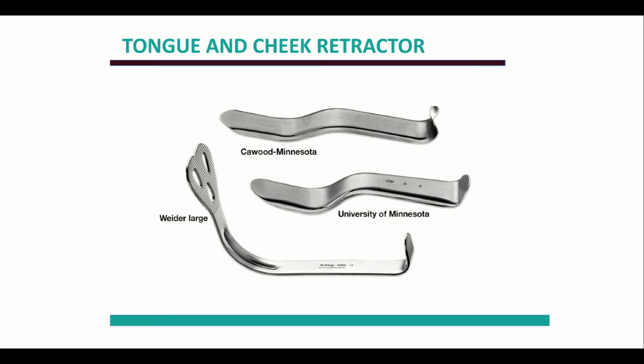Tongue-in-cheek retractors. There are a number of different kinds. Notice that this one here is from, I would assume, the University of Minnesota. I really never thought about this before. Everybody calls these Minnesota cheek retractors. So maybe they invented it at the University of Minnesota. I'm not sure. But anyway, these are commonly called Minnesota cheek retractors. And there are many other types of tongue-in-cheek holder.